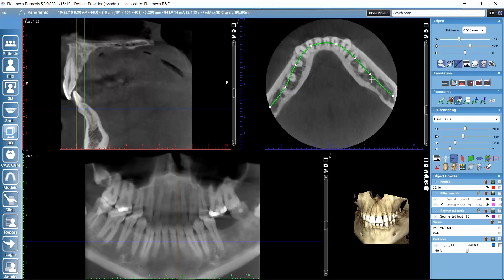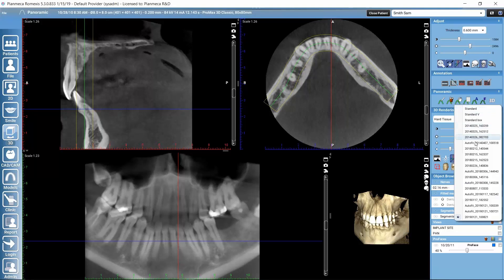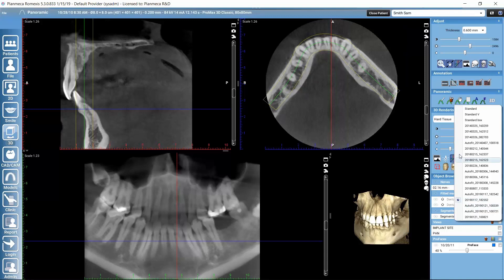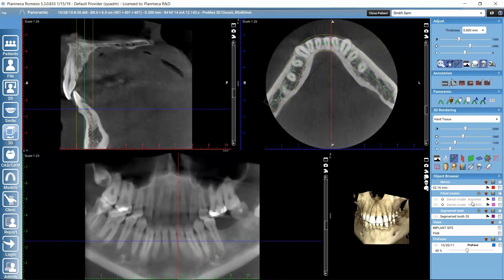With Control held down, we get that pen icon visible for adding or removing points. For the same patient, we can have several panoramic curves saved. We can view the list of all panoramic curves by opening that icon. Here we have a list of all previous curves. We can select a curve in the list and use the trash icon to delete it.